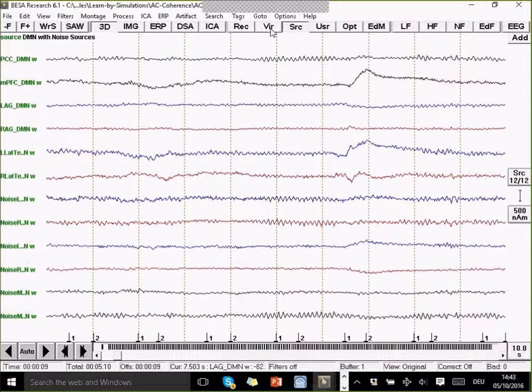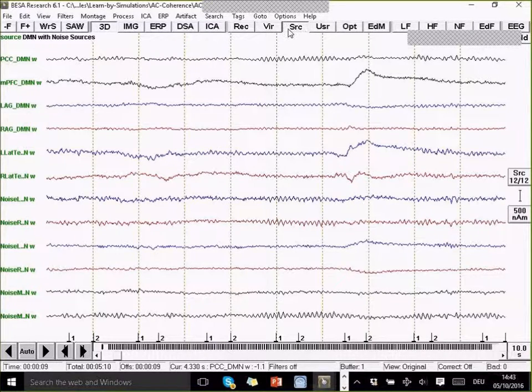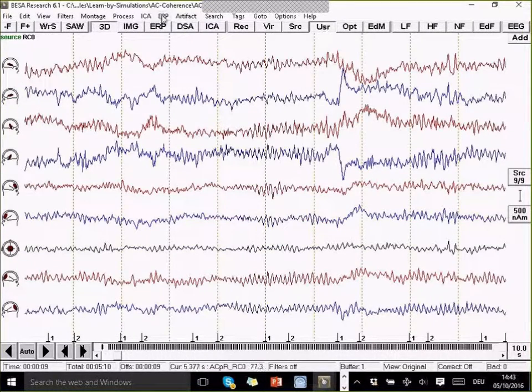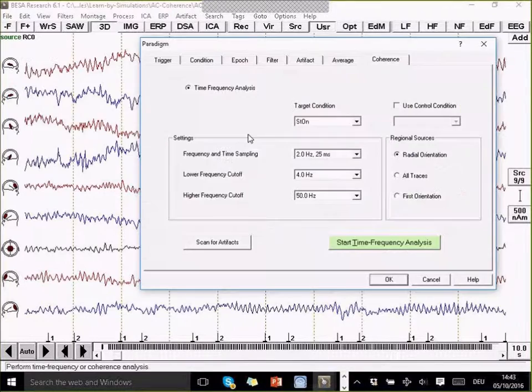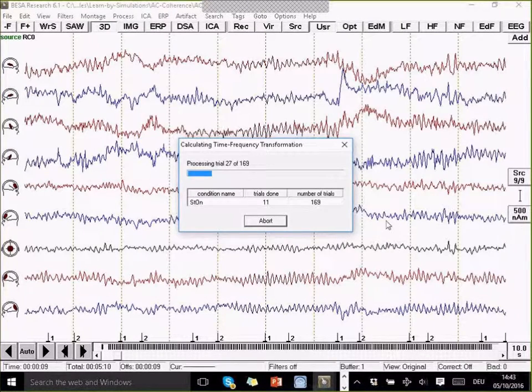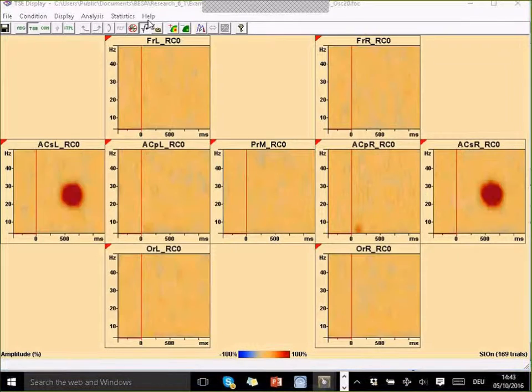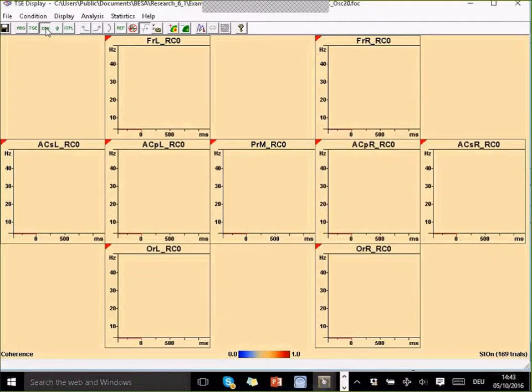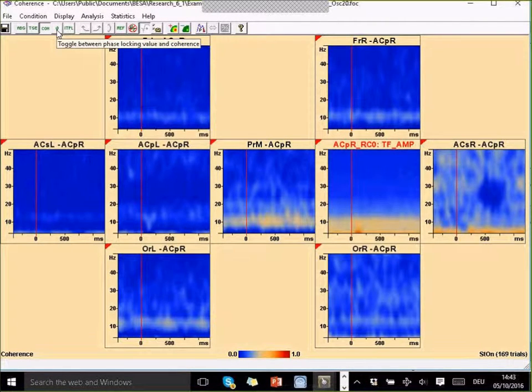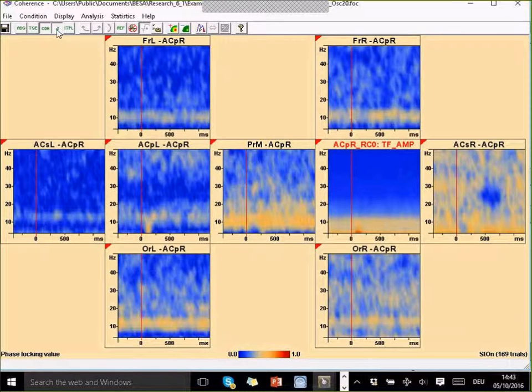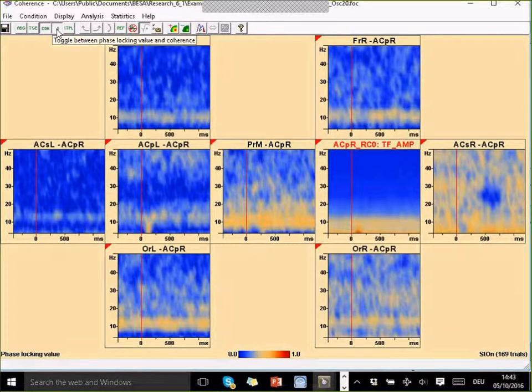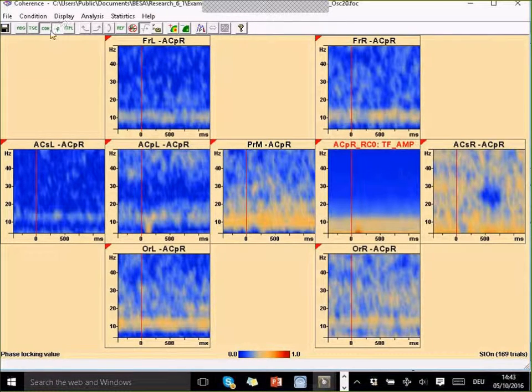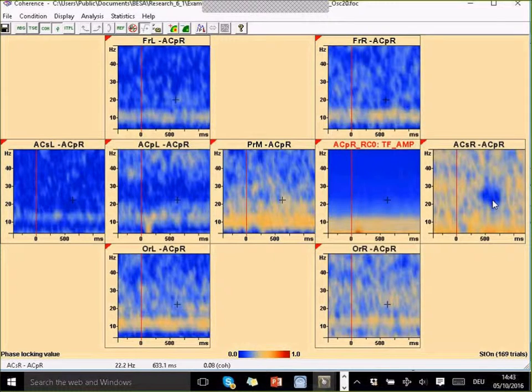This is also something we have in the coherence module. If we go back to the coherence, instead of calculating coherence, we can also calculate the phase locking value. This is just available from the toolbar in the coherence module.